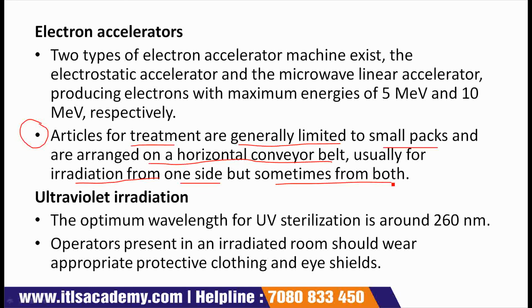Varying extents of shielding depending upon the size of accelerator are necessary to protect operators from X-ray generated by the Bremsstrahlung effect.